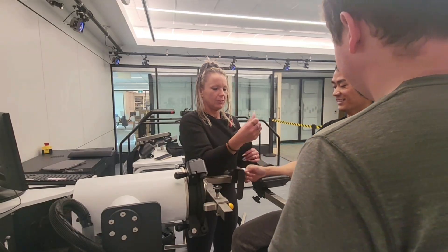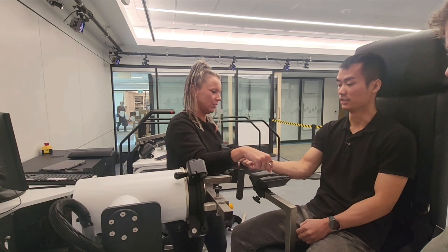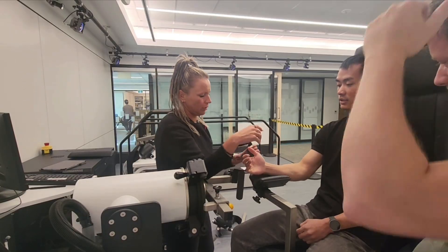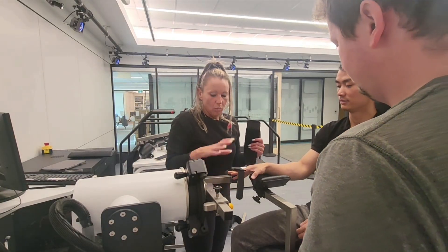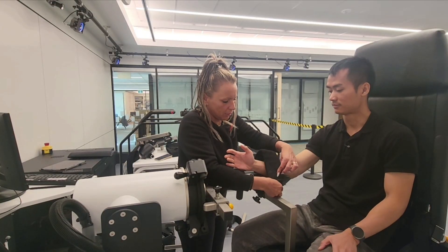Forearm again, same as before. So last time we did this — now we're doing supination. It's together. So we will adjust heights and everything, but really this is what we're kind of looking for.